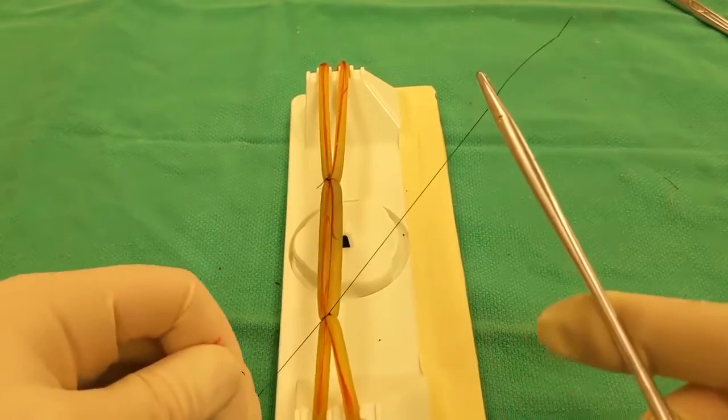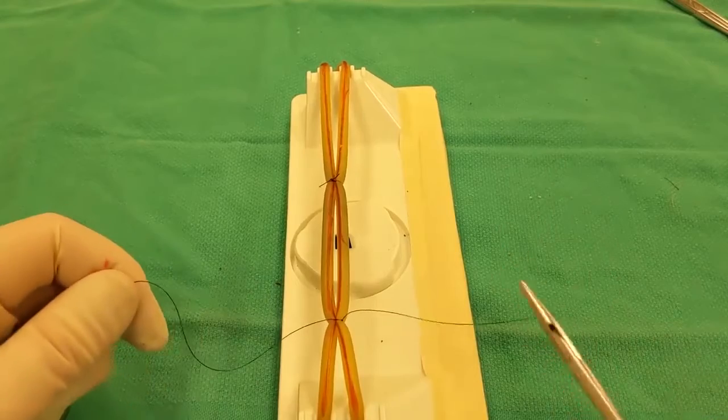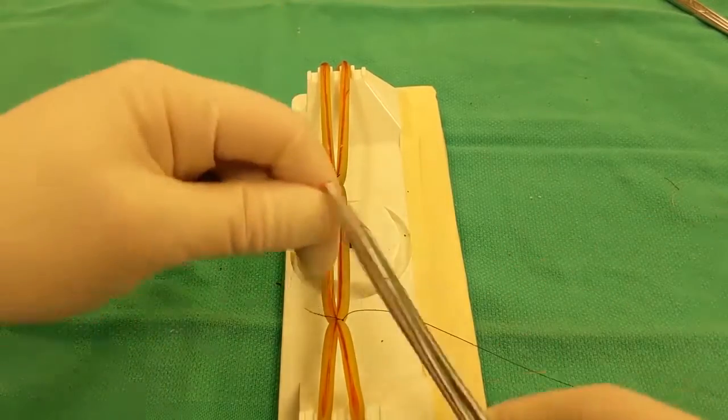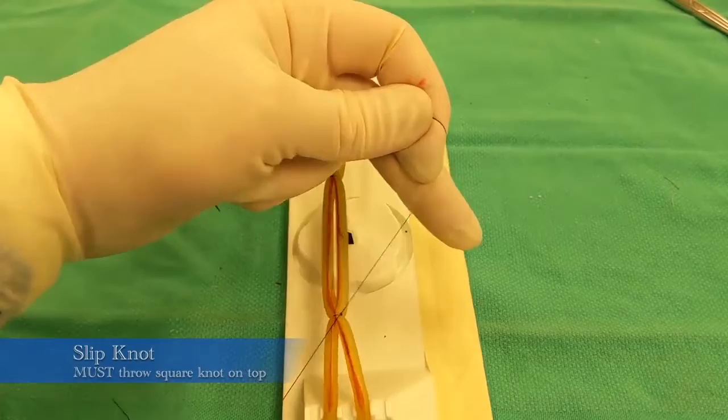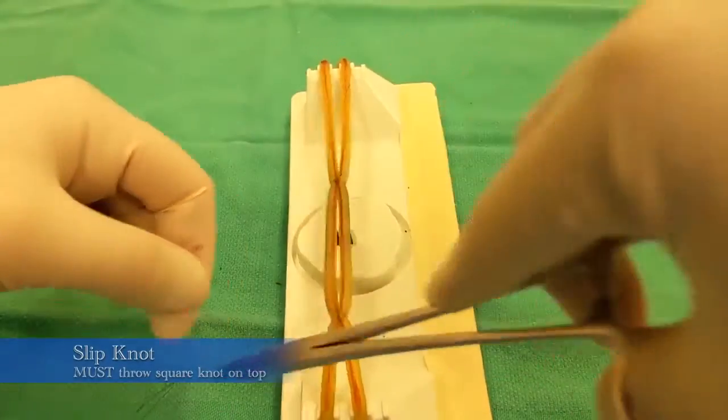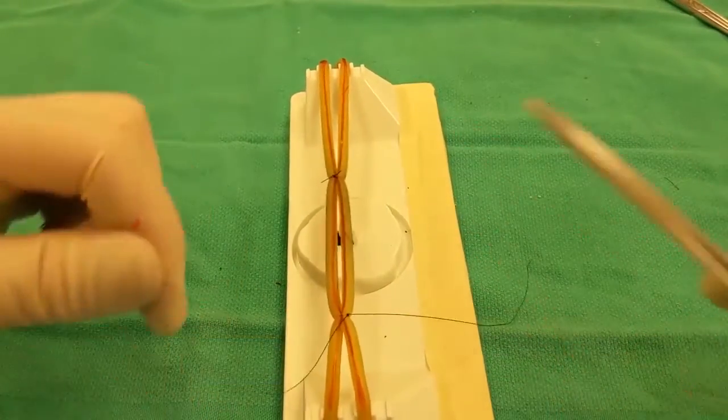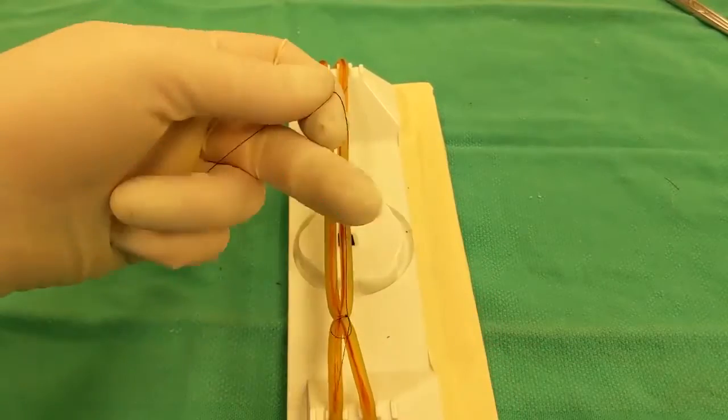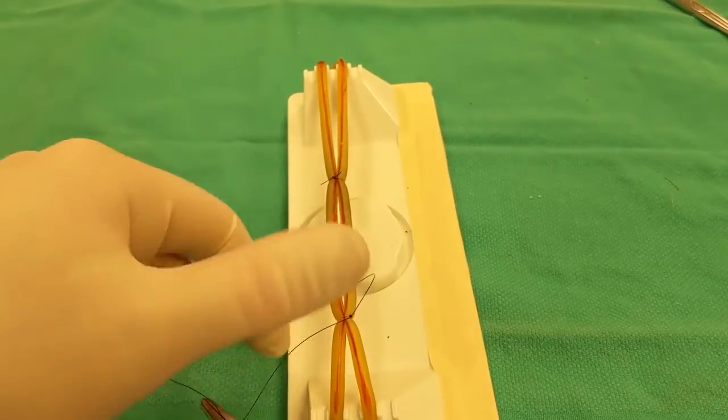So it's really important to recognize this, because half hitched or slipknots are not secure ligatures on their own. They must have a non-slipped square knot tied over it to lock the ligature in place. If additional slipknots are inadvertently placed instead of square knots, the ligation is prone to slippage and post-operative bleeding.